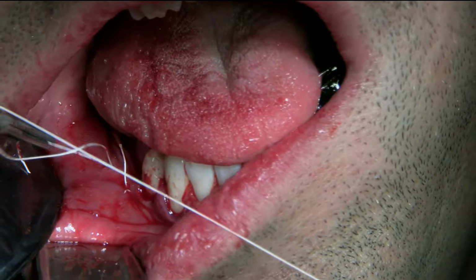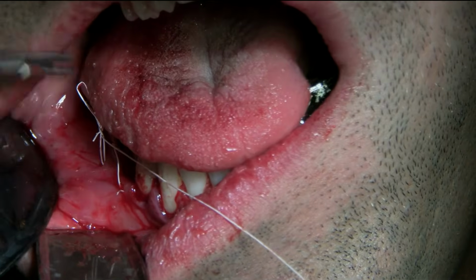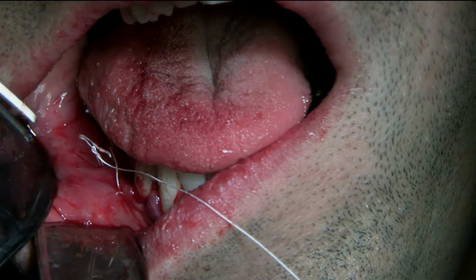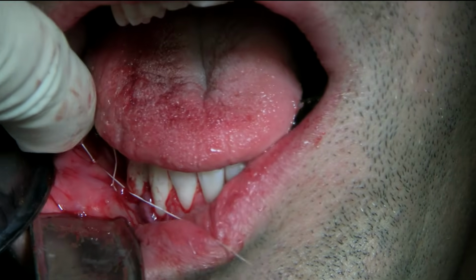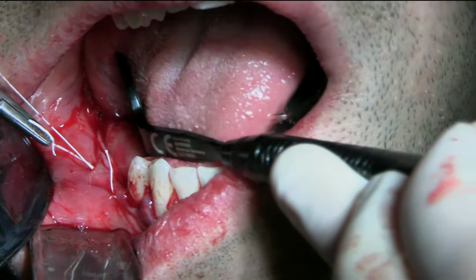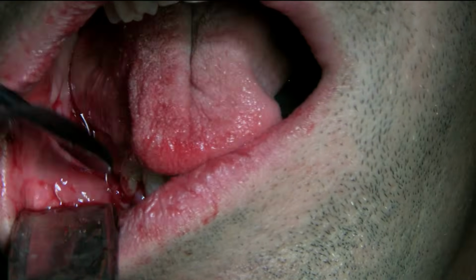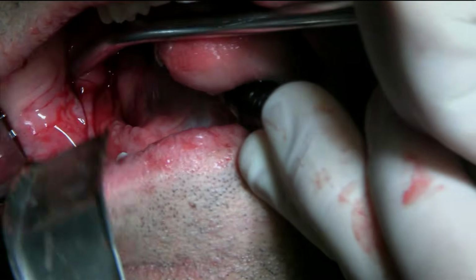There's a question for you. Okay, ready for it? Just repeat the question when I read it to you. From Hooksa: does the collagen membrane compromise blood flow on the region that you place with the PTFE? Does the collagen interfere with any blood flow? So I just got a question from YouTube, from online, and they're asking if the collagen interferes with the blood supply.